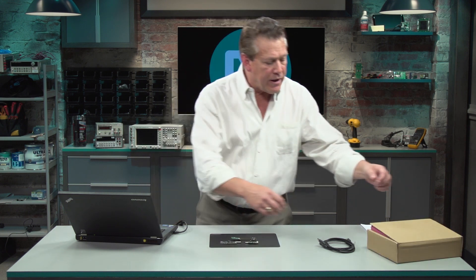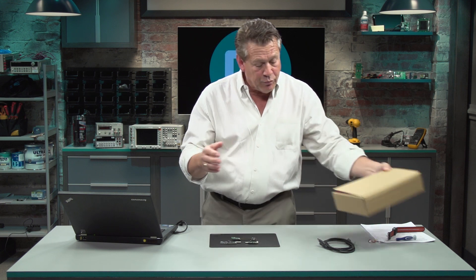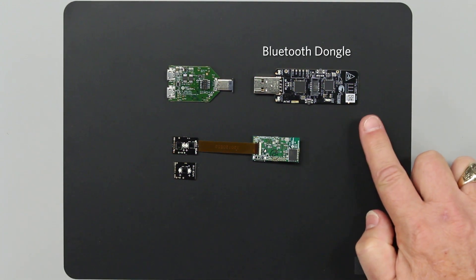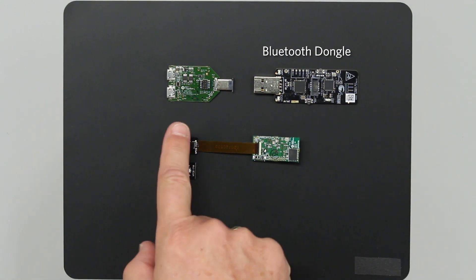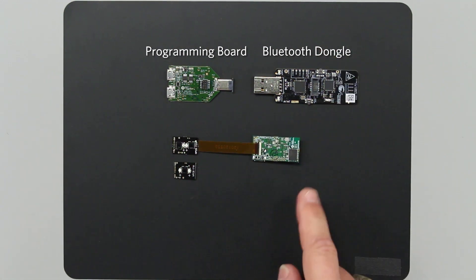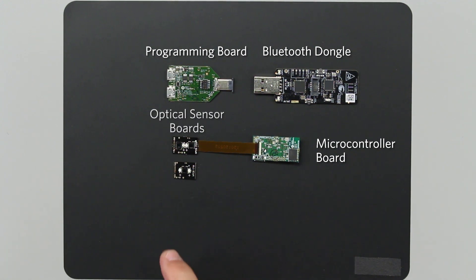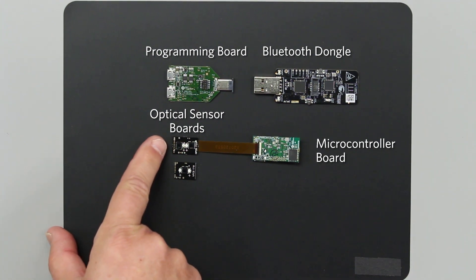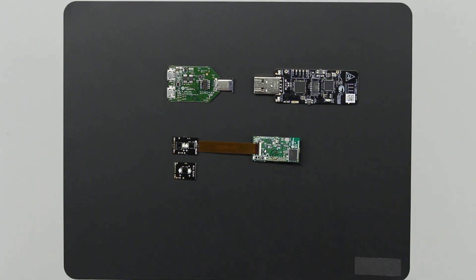When we order the MAX86140EVSYS EV kit, inside the box we get the following contents. We have a Bluetooth dongle board so we can communicate through Bluetooth to the PC. There is a programming board where we will update firmware as it becomes available. There is a microcontroller board which is the interface board for the two optical sensor boards — the MAX86140 sensor board and the MAX86141 sensor board — and then there's a flex cable that connects between the optical sensor board and the microcontroller board.